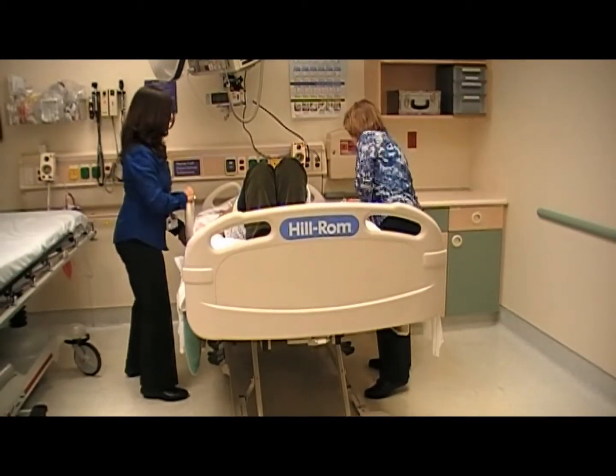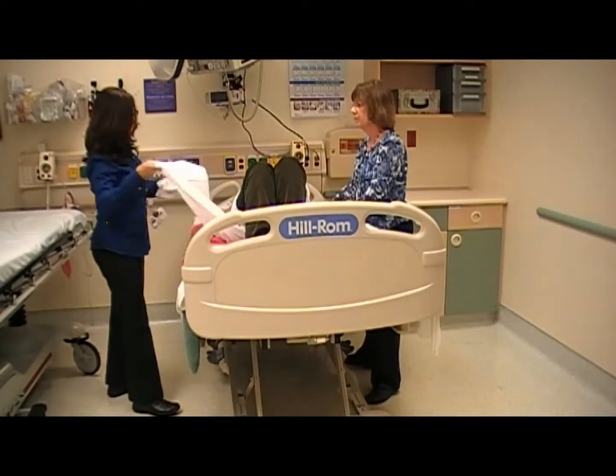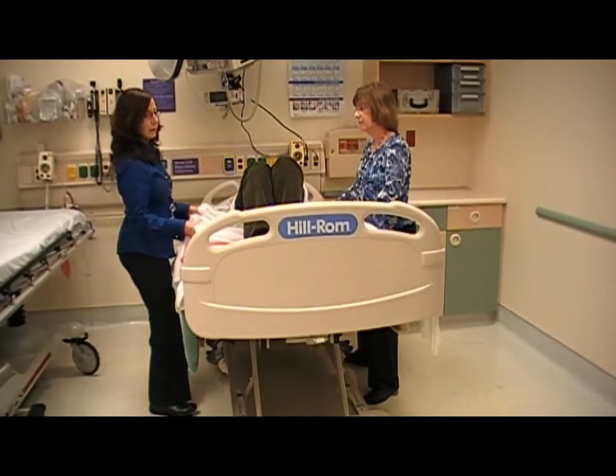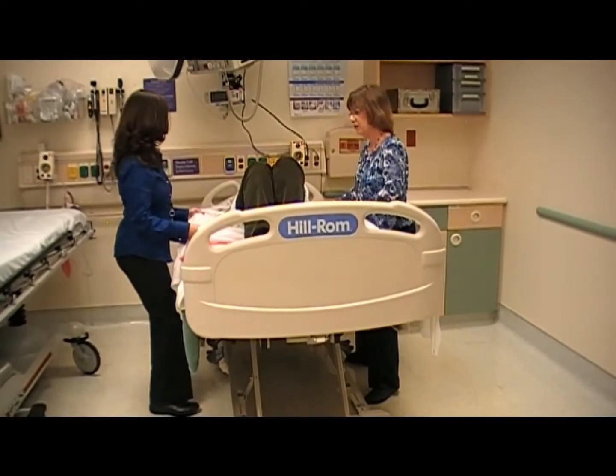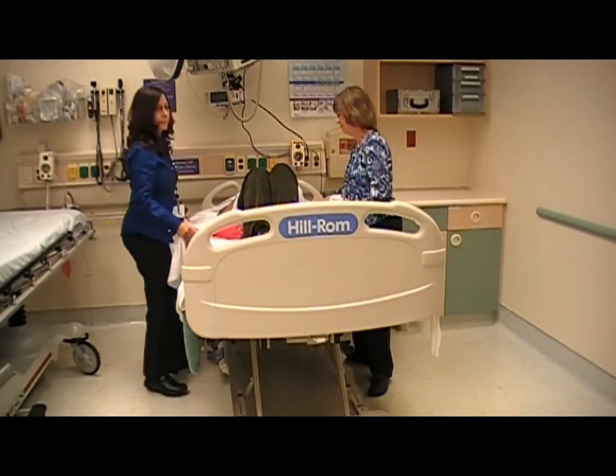Contract your abdominal muscles to support the spine. Keeping the knees bent and your elbows close to your body, shift your weight using the legs in the direction you want to go. Do not lift, simply slide the draw sheet over the pink slip to move the patient up in bed.